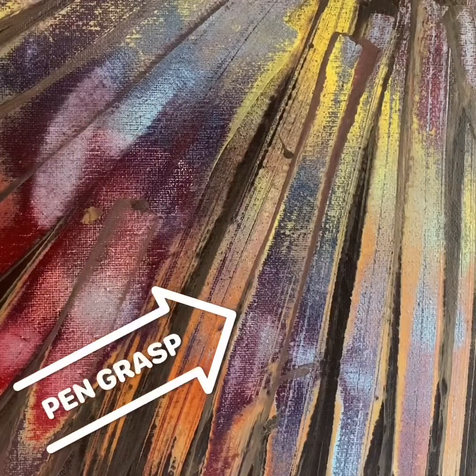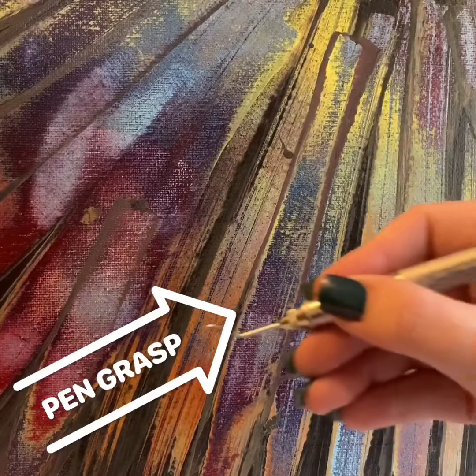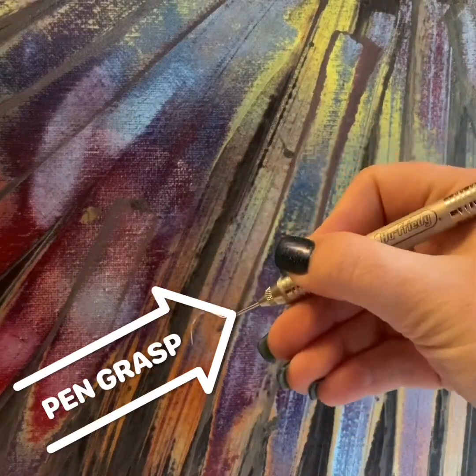First we're going to start off with the pen grasp. As the name indicates, it is when an instrument is grasped in the same manner as a pen or pencil. I'll demonstrate. So just as if you were writing your name, this is how you would hold the instrument.